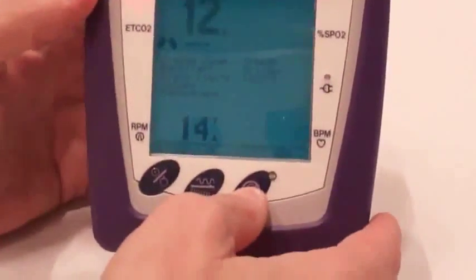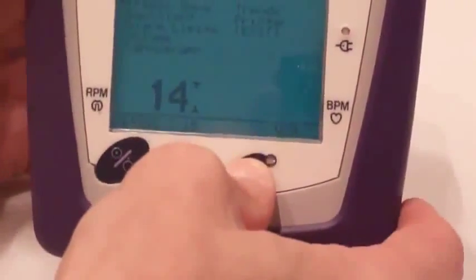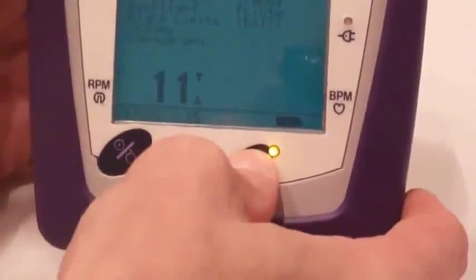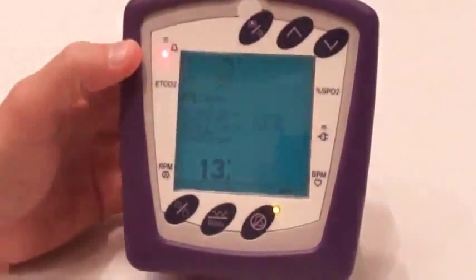So if you want to silence the alarms you can just press that button right there in the bottom right hand corner until you see the yellow lights stay on permanently. That silences your alarms.